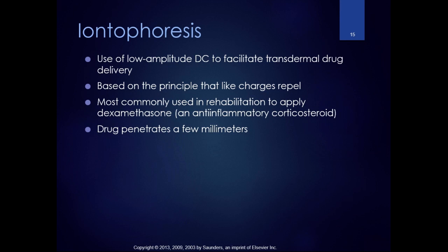So with iontophoresis, we're using low amplitude direct current to facilitate transdermal drug delivery. So we're actually pushing it's a negative or positive medication, and we use the polarity of the charge to push the drug into the skin. Most of the time, I've used it one time with acetic acid, otherwise known as vinegar, for an orthopedic condition.